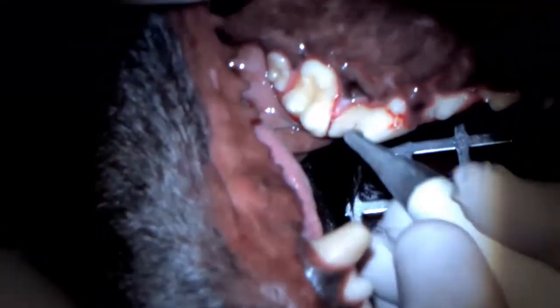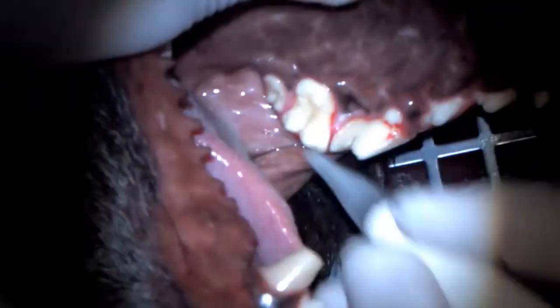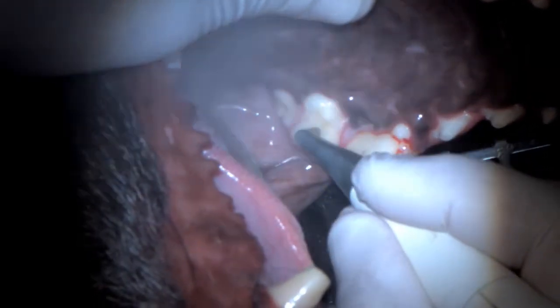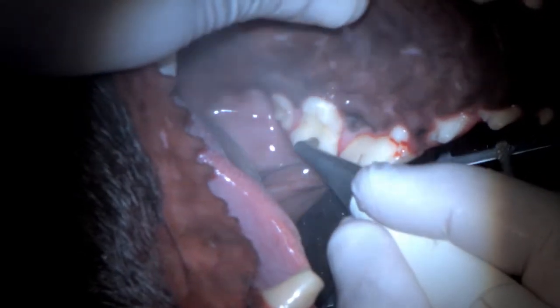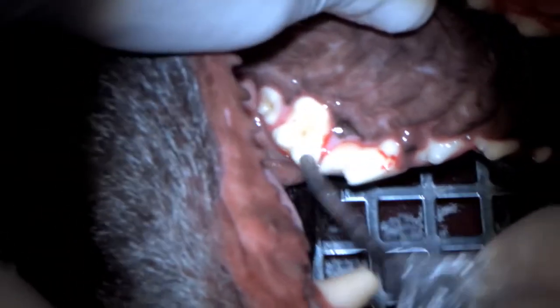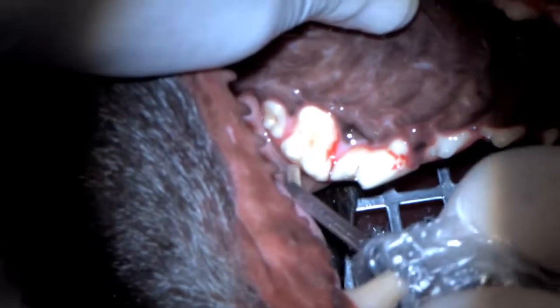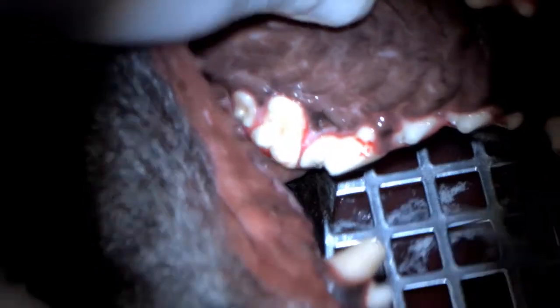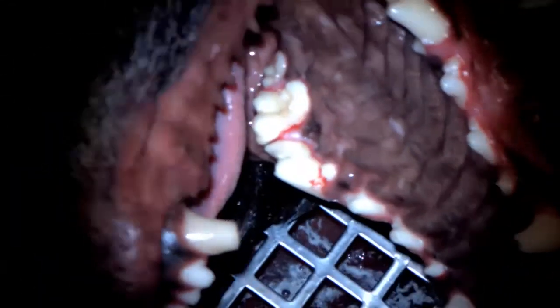Yeah, I think I'm happy with that. I'm using an air abrasion technique based on a slurry of sodium bicarb to clean the area. Now we'll go through the various stages of bonding a composite restoration.